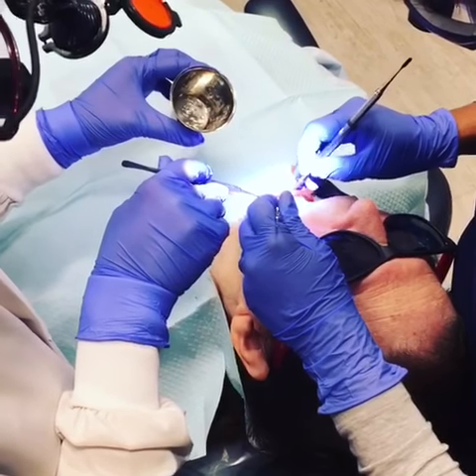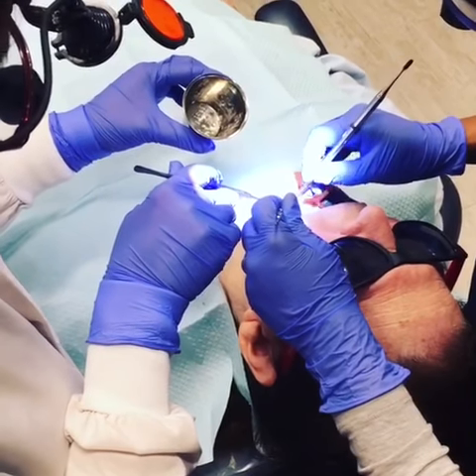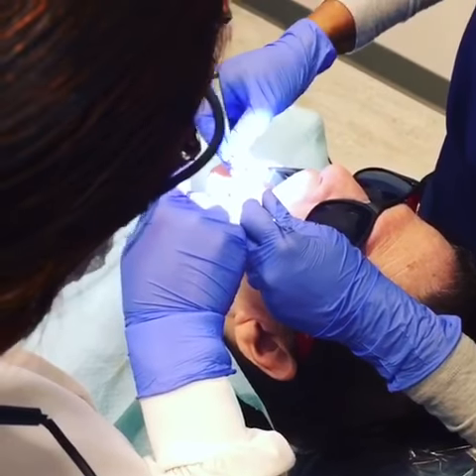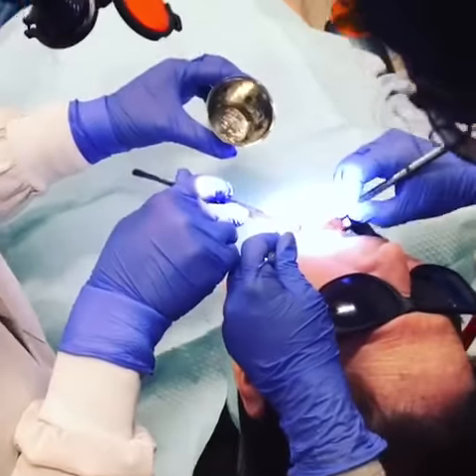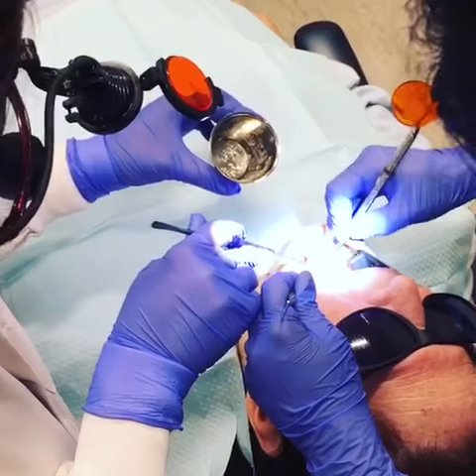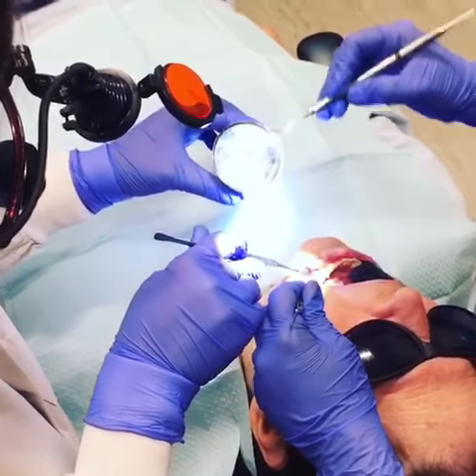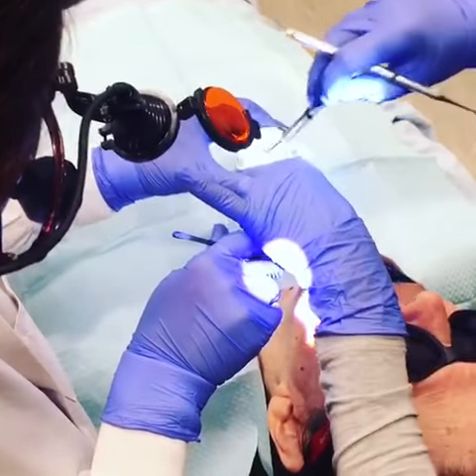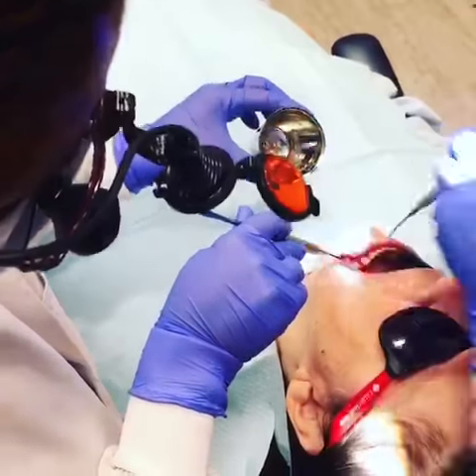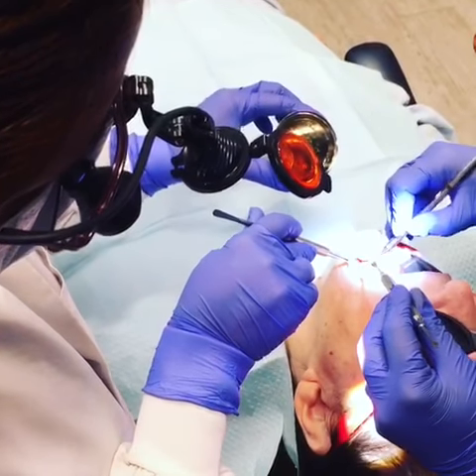Do you place your membrane after the graft? You could do it before or after. If you're doing before, you want to tuck it in on one of the flaps — in this case I would have done it on the lingual, because buccal we need to graft. But since we have this full flap open anyway, I can do it after.